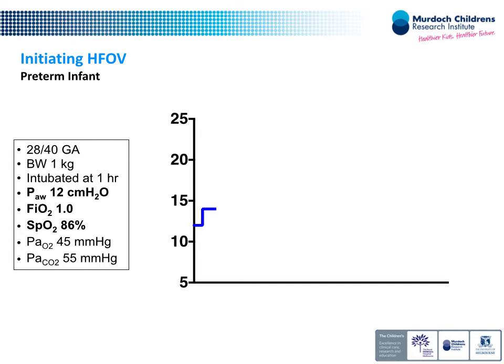No, you've got a compliance of 0.32 mL per kilo per centimetre of water. Okay? And assume, depending on what country you're in, right? But let's assume we have a PEEP of 5 to 6. That's going to give you a reasonably high delta P there to get that. And we've set our I time efficiently. Okay? So we have a problem of compliance, and we don't yet have a problem of pulmonary hypertension. This is a fresh HMD type picture. So we may have an X-ray.